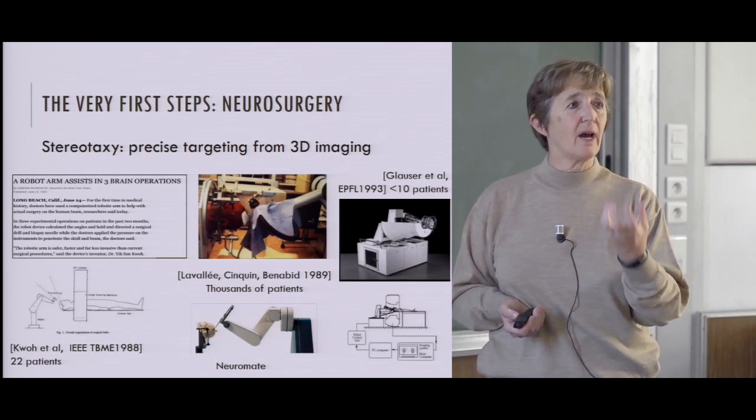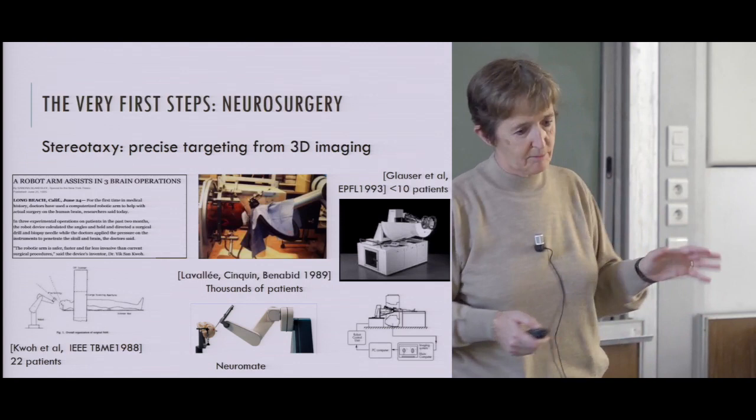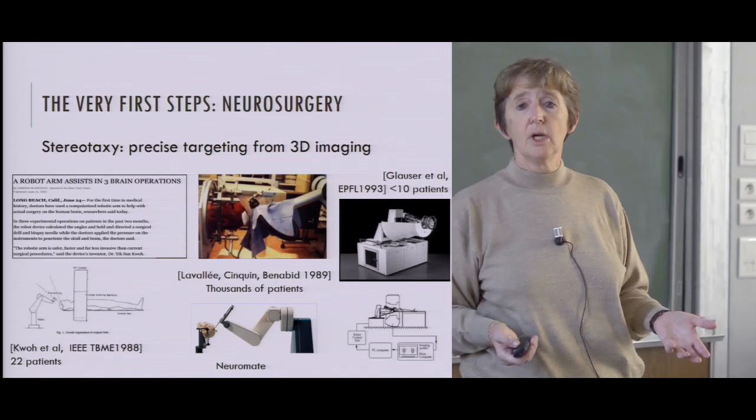So this is really to introduce to you the fact that what we want to do, at least in my lab, is to put robots on functions that the clinician is not able to do perfectly. There are many things he's able to do, and so in that case, it's not necessary to automate this.